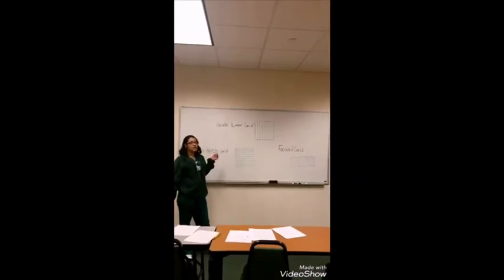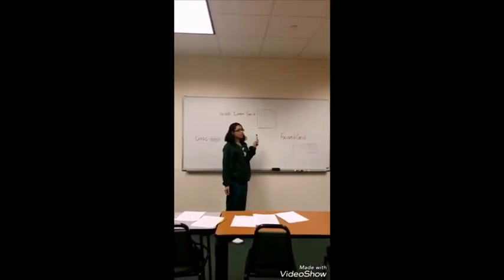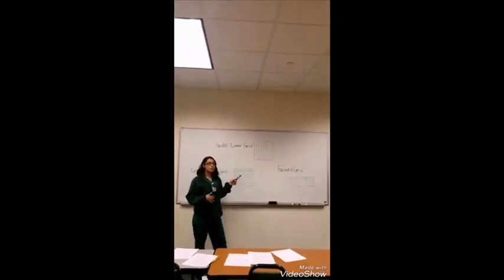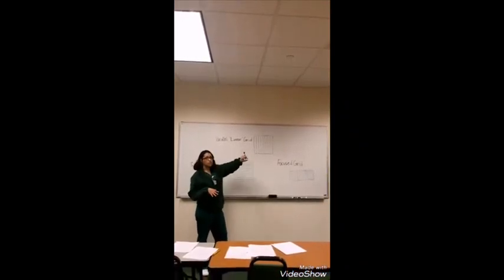Now we'll be speaking about the types of grids that we use. This is the parallel linear grid. It's the simplest form of grid, and it cleans up scatter in one way. This is not recommended to be used with a large image receptor or a short SID. The diverging X-rays are absorbed by the edge of this grid.